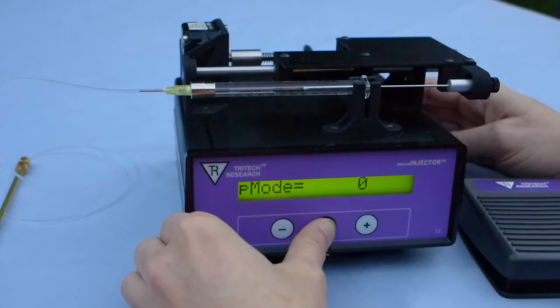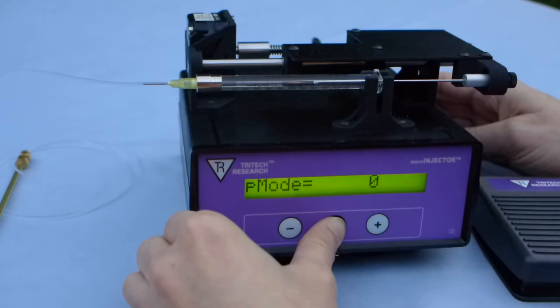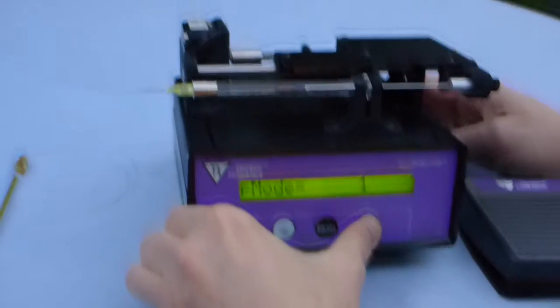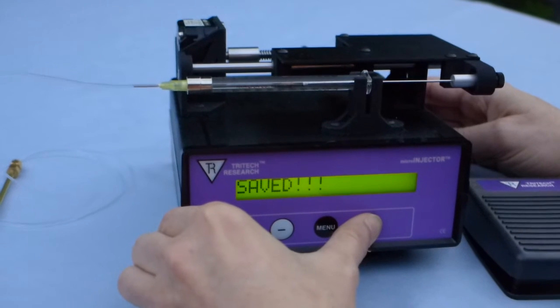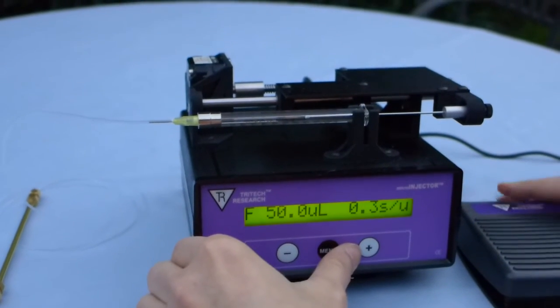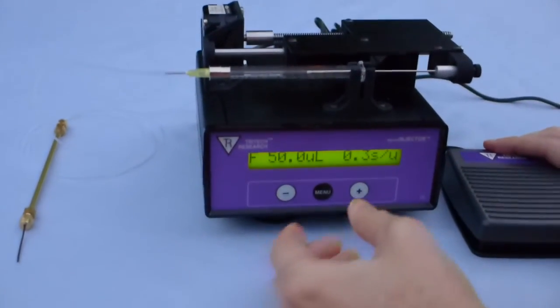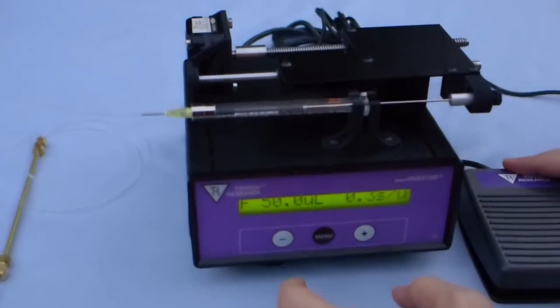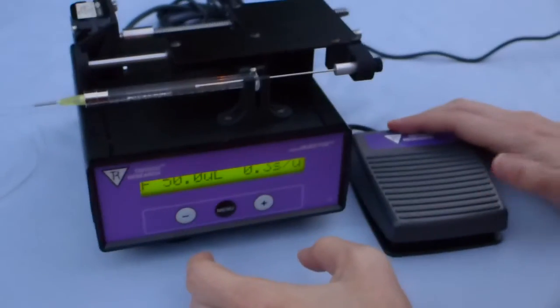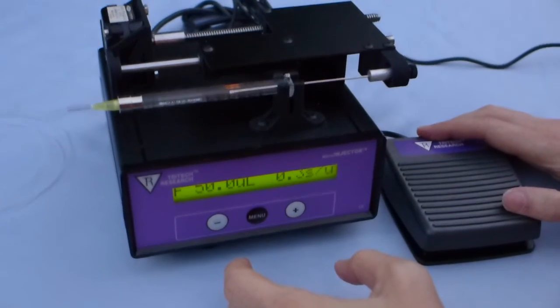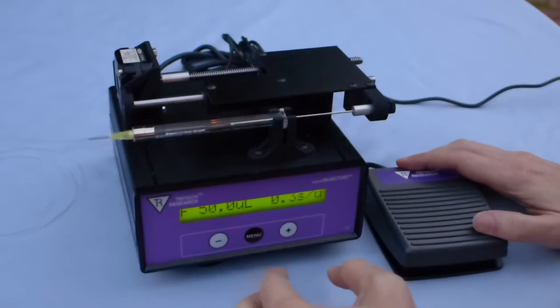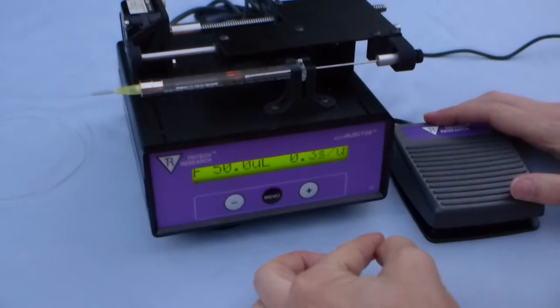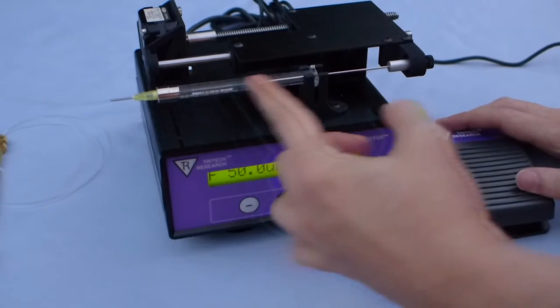P-Mode is something brand new. This lets you use this as a pressure type injector instead of just a positive displacement injector. So what you can do is you can set P-Mode to 1, and now the behavior of the device is going to change. So normally when you hit the foot pedal, it'll just go in the direction that it's supposed to go in based on forward or reverse, and then it'll stop, and that's the end of it. And you don't have to hold down the foot pedal. You just click the foot pedal, and it'll do what it's supposed to. In P-Mode, which is pressurization mode, it'll move forward the volume that's set, and then while you're holding down the foot pedal, it will stop. Then when you release the foot pedal, it will return back to its original position.